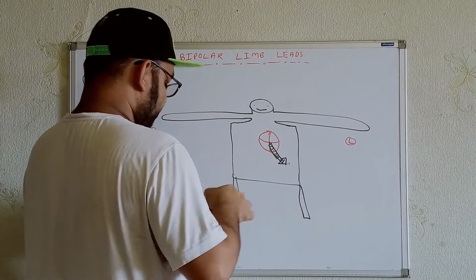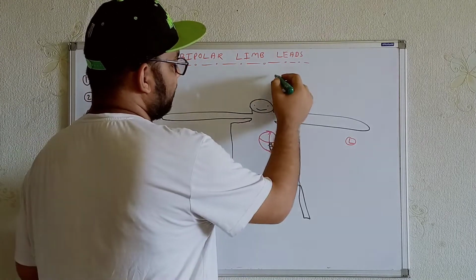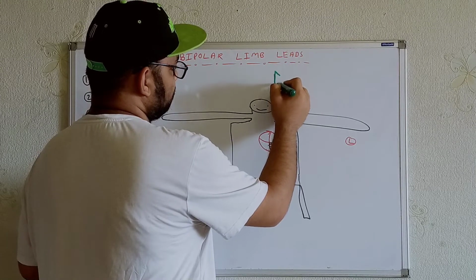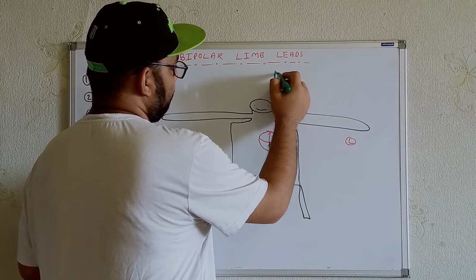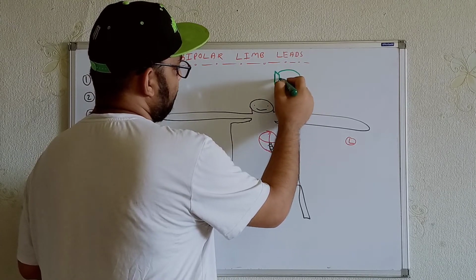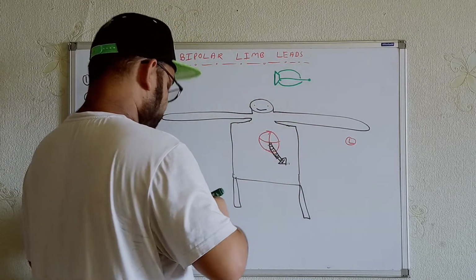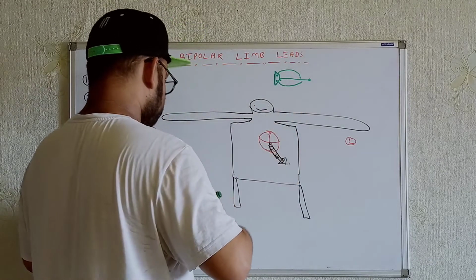Now I can use different kinds of electrodes over here. First I will use one on top, for example, let me show. Just like this, there are two electrodes that will be connected to two regions.